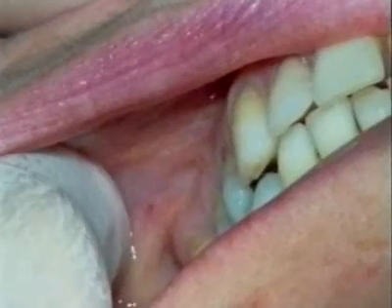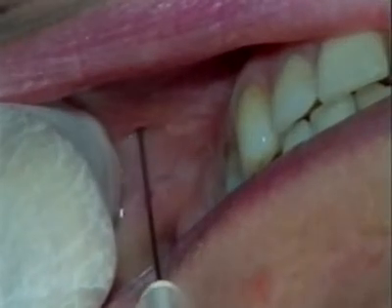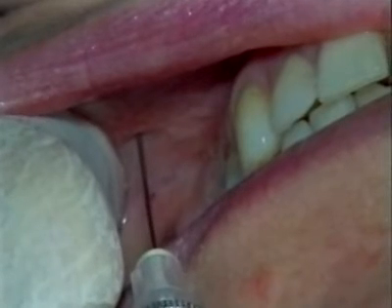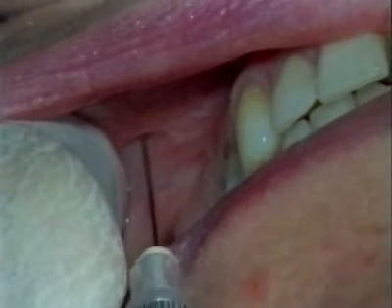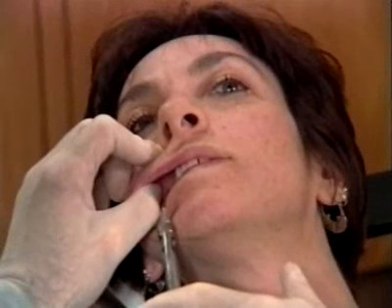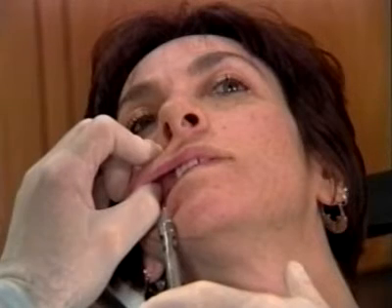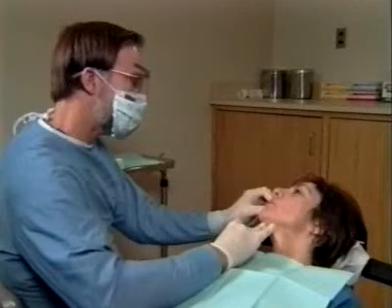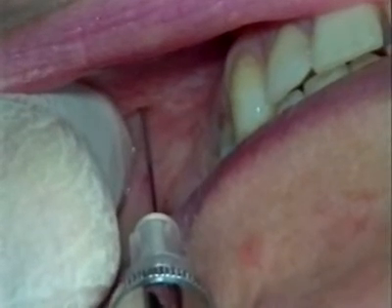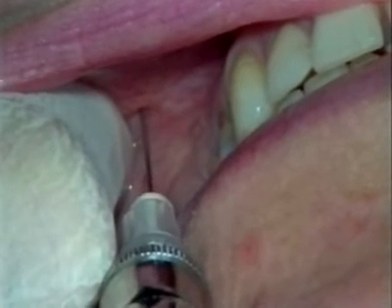The needle is then inserted vertically, about 5 millimeters lateral to the second premolar and parallel to the long axis of the tooth, with the bevel of the needle facing distally. The orientation of the needle as seen from the front of the patient should mirror a vertical line defined by the medial aspect of the pupil and the infraorbital foramen. For this and other injections described in this program, a few drops of anesthetic, expressed as the needle is slowly advanced, is useful to minimize discomfort.